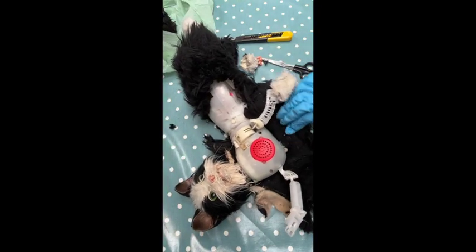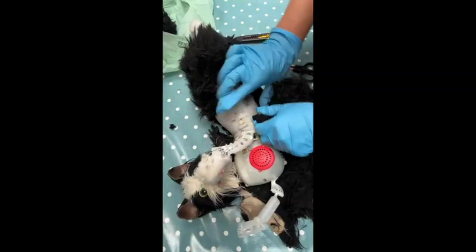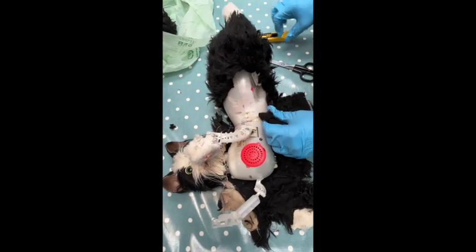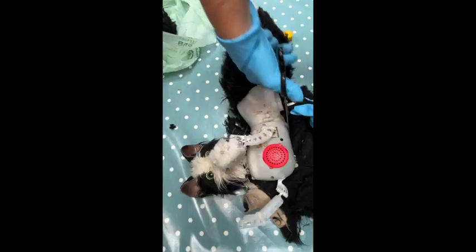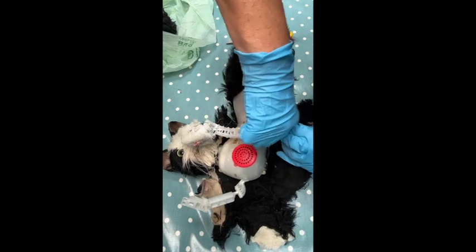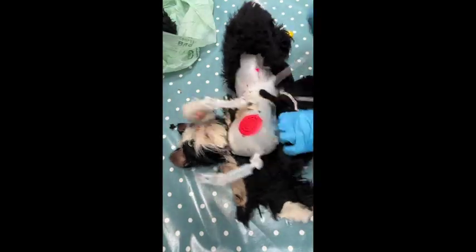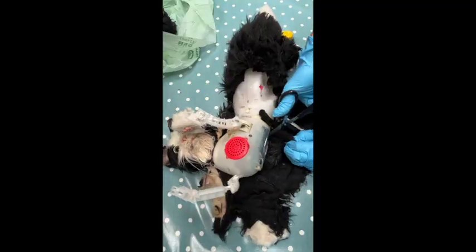Okay, no more attachments to the fur here. There's attachment to the body base here. It's a long line of stitching along the base there. Doesn't go on forever. Let's cut through and see where we can get to next. Oh, it's smelly. Overwhelming smells sometimes.